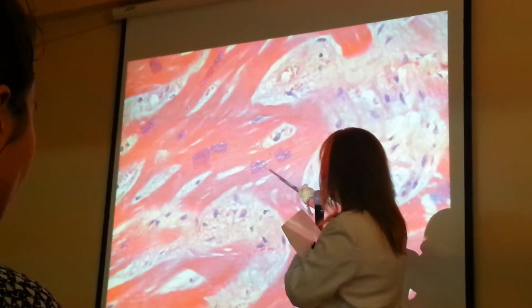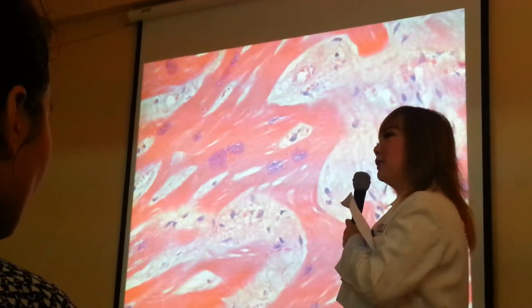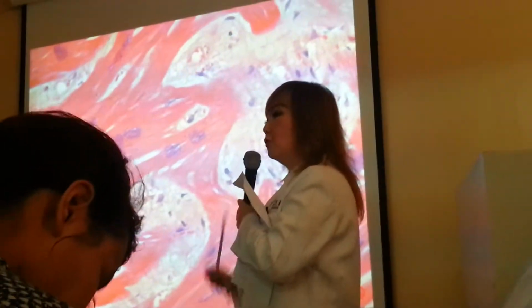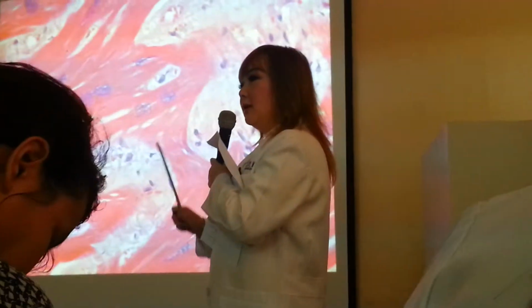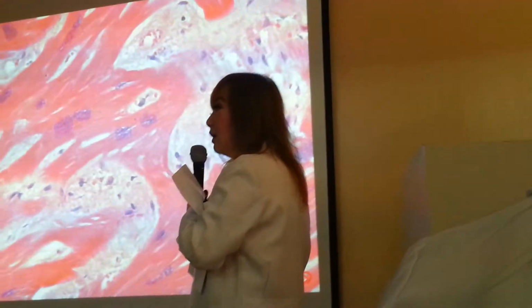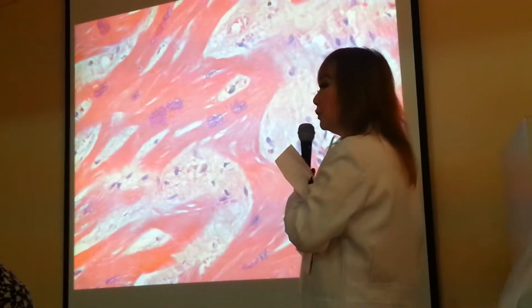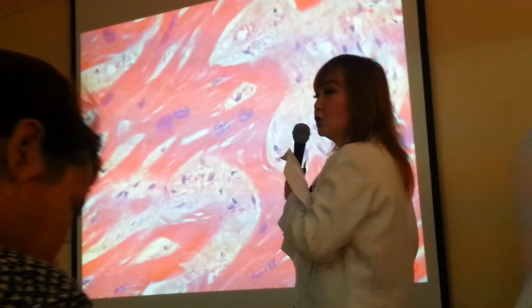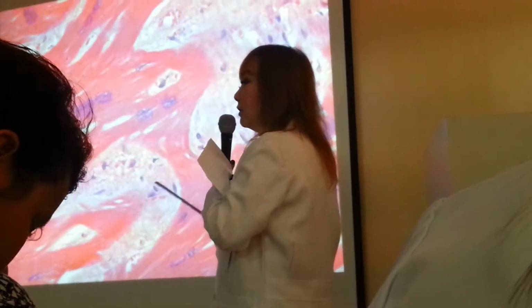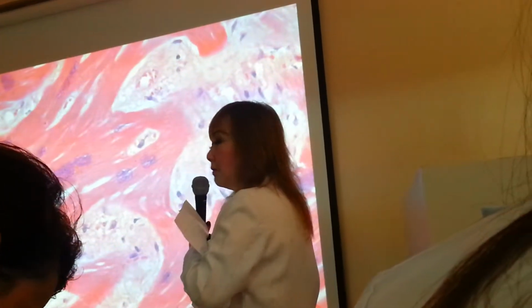And the nucleus will be enlarged. Some would be kind of hyperchromatic, which means there's an increase in the nuclear staining from a slight purple to a deep purple. That's when you say hyperchromasia, hyperchromatic. The normal would be what? Normal chromatic, right? So if it's hyper, then you can just assume that it's slightly darker than the normal.